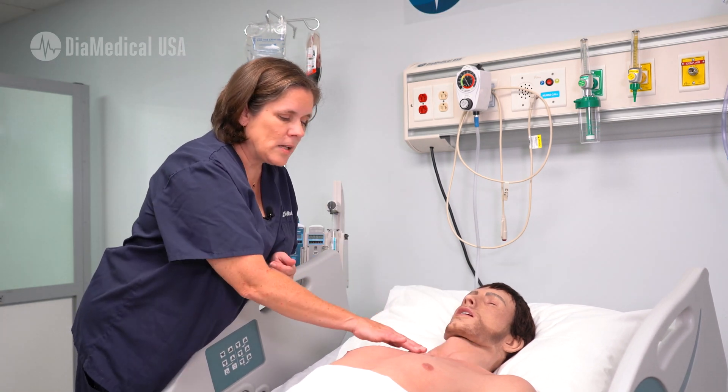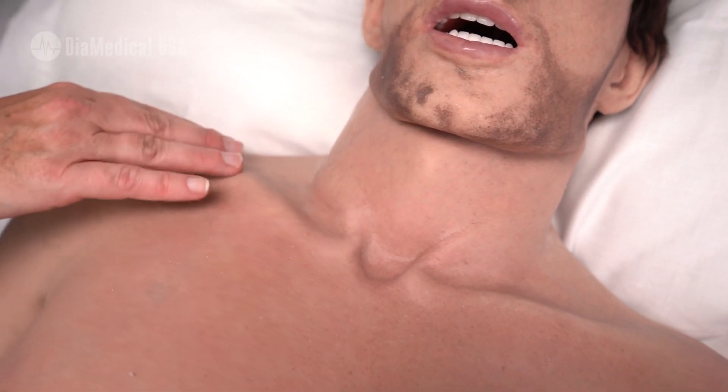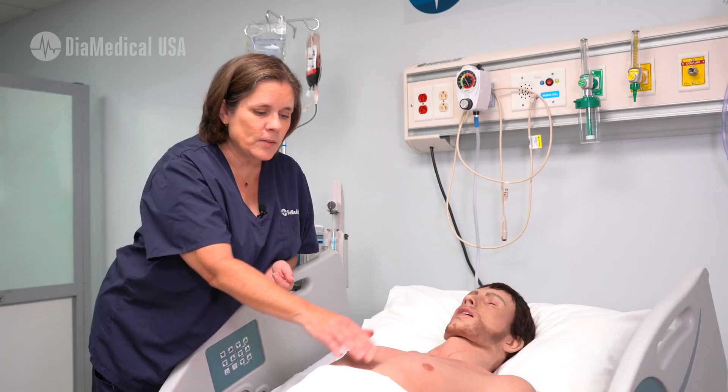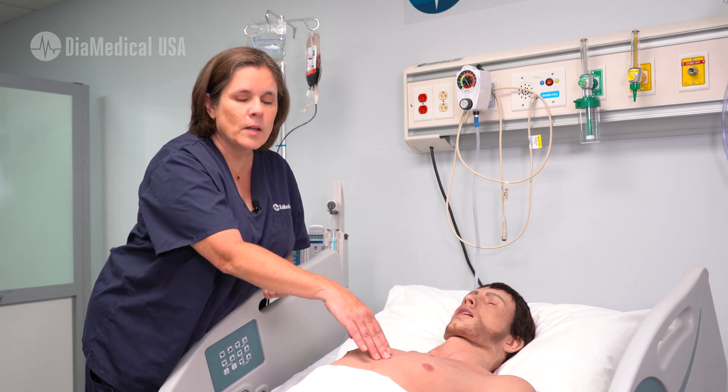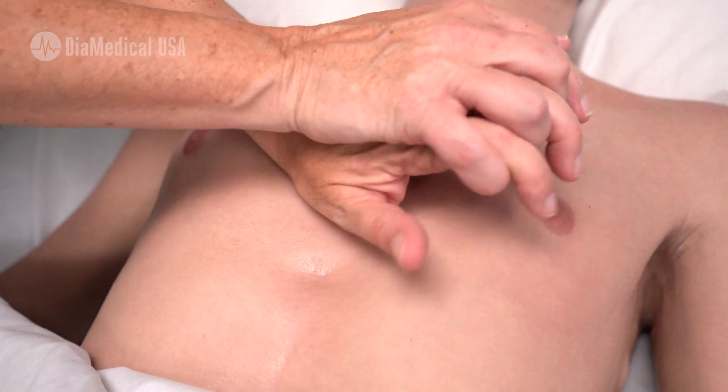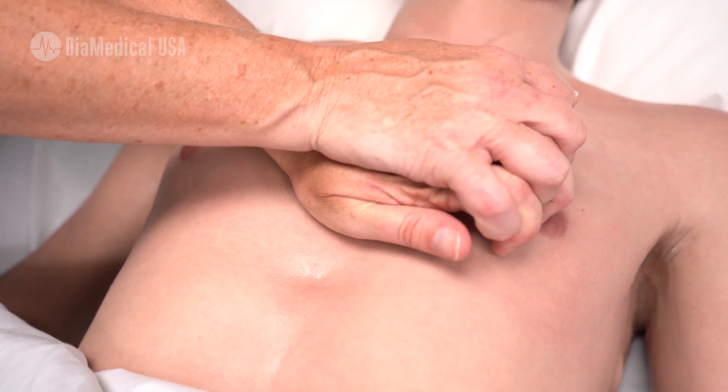He's got real anatomical features with the clavicle running across here. He's got the sternum with the xiphoid process, and you can actually depress the sternum the full two inches to get good chest compressions for cardiac CPR.